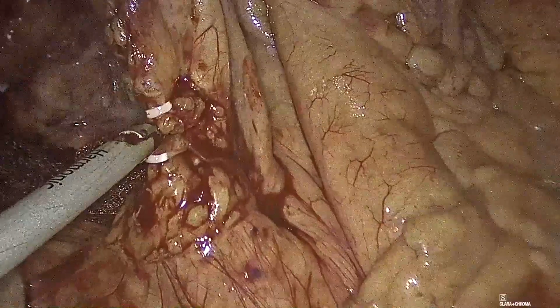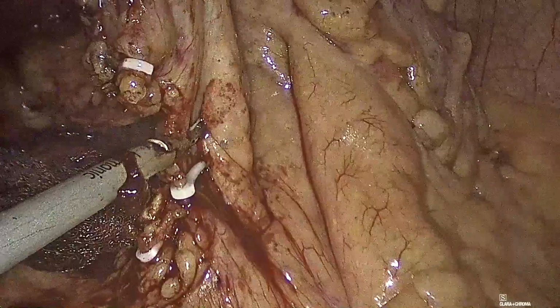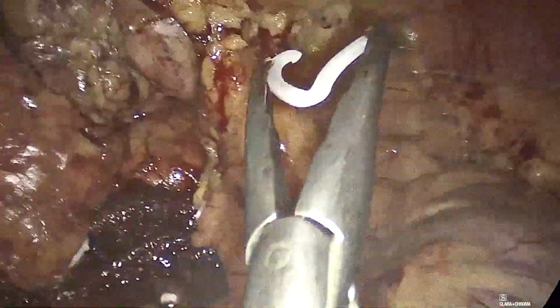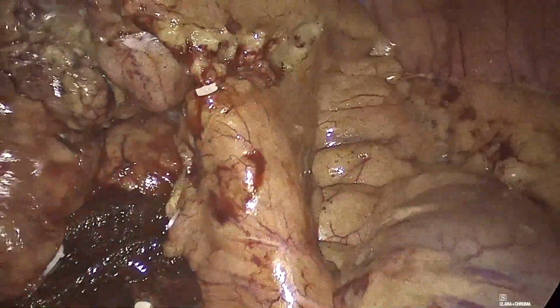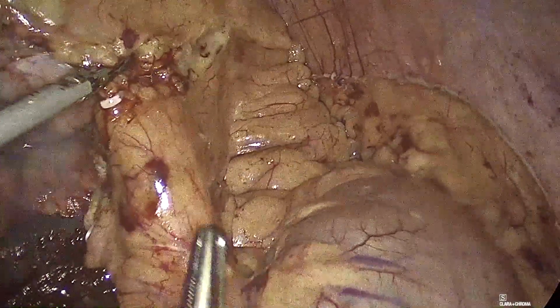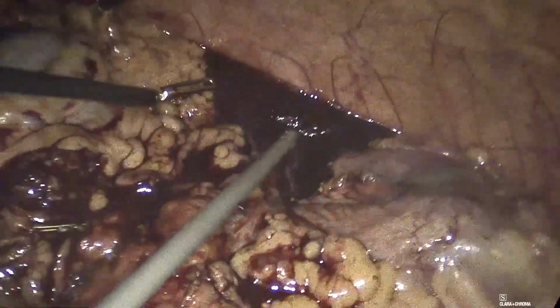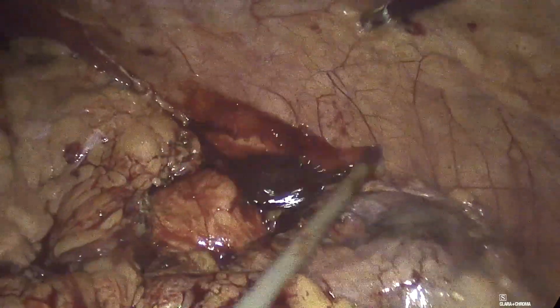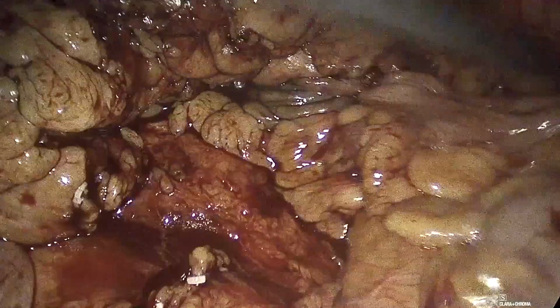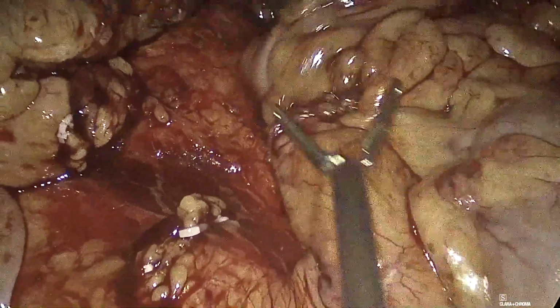Dissection of the mesentery to the point of bowel transection was done, and a few sigmoid branches were taken on the way along. Thorough washout was done, hemostasis was maintained. Length of the bowel for tension-free anastomosis and orientation of the mesentery was checked.